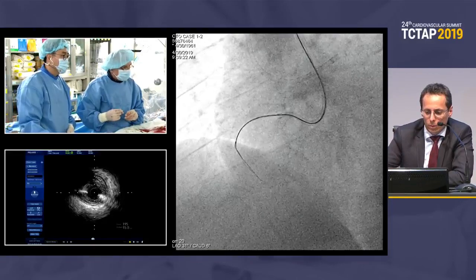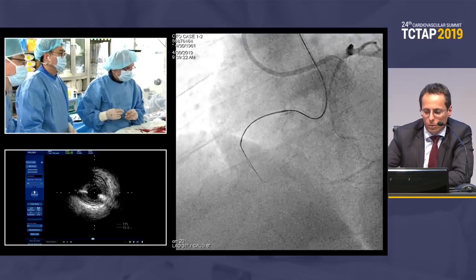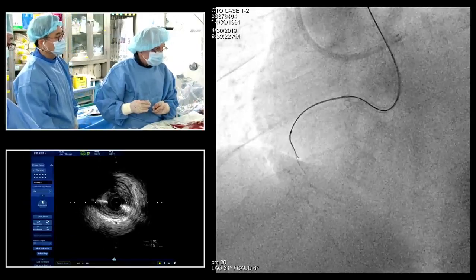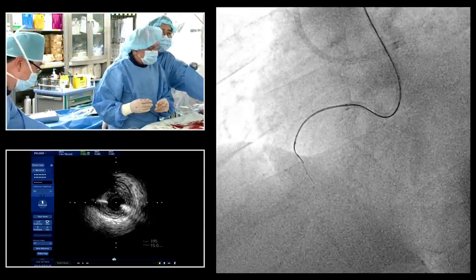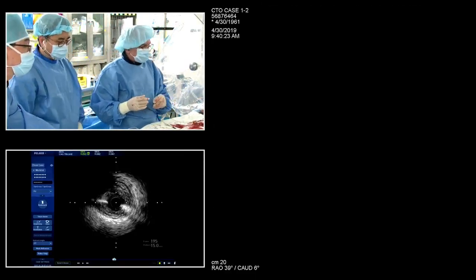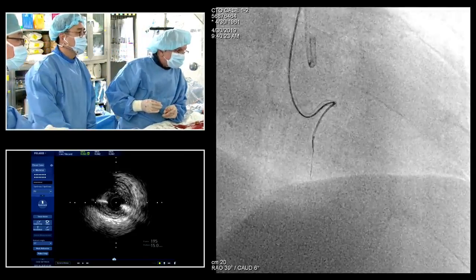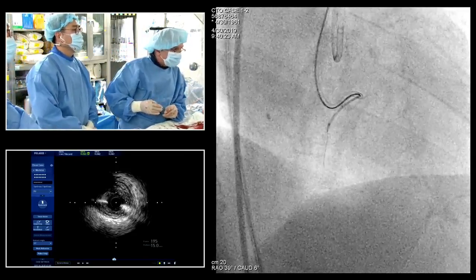Do an injection. Injection, left side. Yeah. Stop. Okay. Goes too far. Okay, I think that let's go to RAO. RAO would help you a little bit more here for the proximal puncture, where the XT went too much to the right side. Probably here you could puncture a little bit more to the left side on the entry. Yeah.